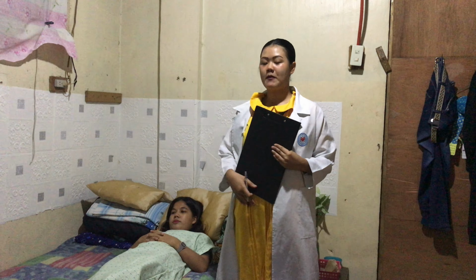So, we have here the materials that are needed for the assessment. We have the alcohol, which is working. And we have here the specimen container, which is clear and clean. We have 2 pairs of pregnancy test kit.